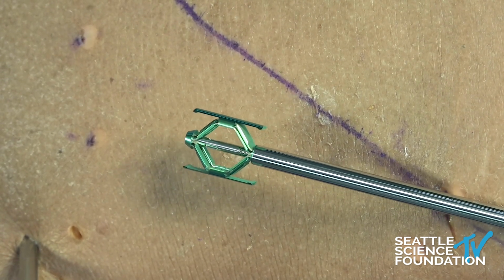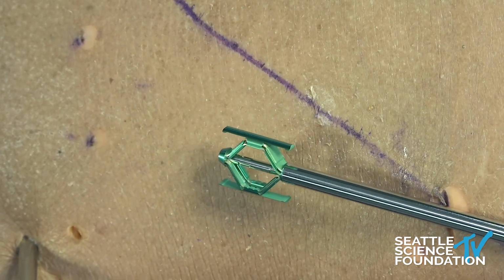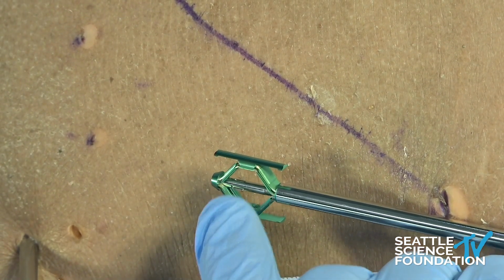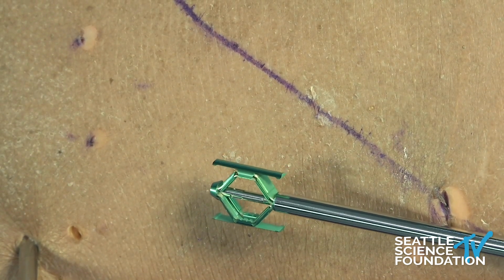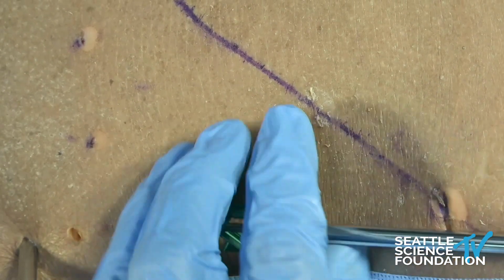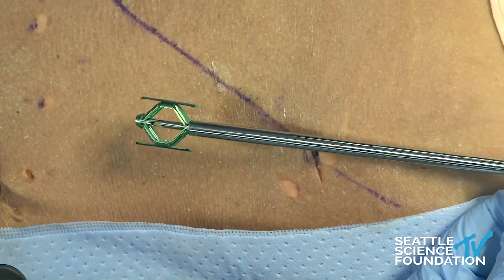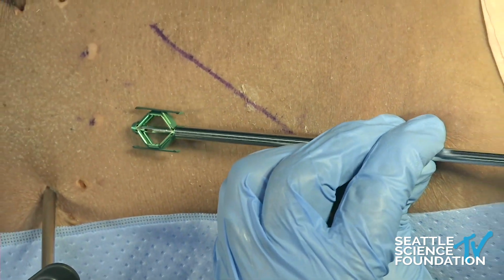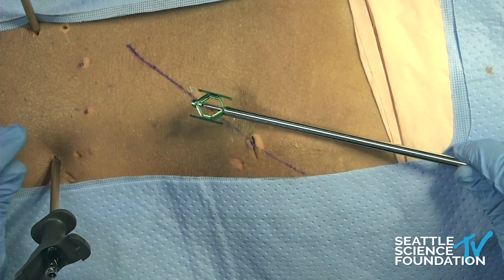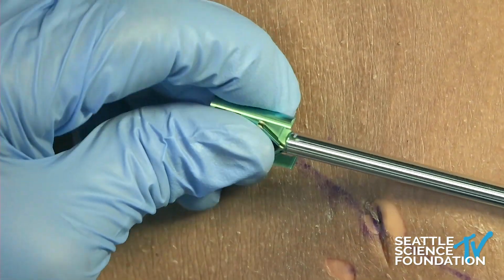So the center post, as we have it in the center, we can see the aperture right here in the center where the cement comes out. So it comes out in the anterior portion of the working channel. As this is deployed, what we do is we take this off, we'll pop this whole thing off, and this becomes the working channel that you inject cement through. This whole thing, proximal, no handle on this anymore. We'll inject cement through this. The aperture where the cement comes out is right here. And then once this is done, this is a collar fit, so this thing just pulls off.